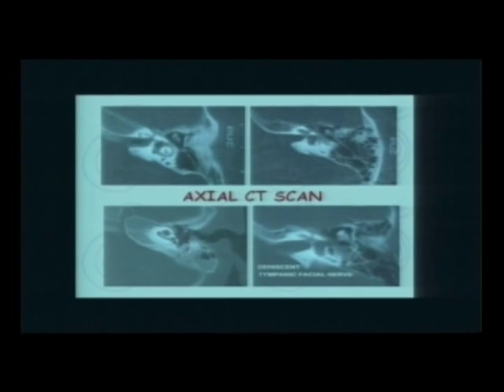And here you can see the mastoid part of the facial nerve, because this is not a pneumatized mastoid, you can see this is the sinus tympani, this is the facial ridge, the facial recess, and right there is the facial nerve in the mastoid going down. So when you cut it horizontally, it appears like a small circle like that. The good thing about the facial nerve is that we all are talking about thermal injury of the facial nerve. And the word thermal means temperature. So all our minds go to heat, because we're using the drill which can heat up the nerve and cause injury to the facial nerve.